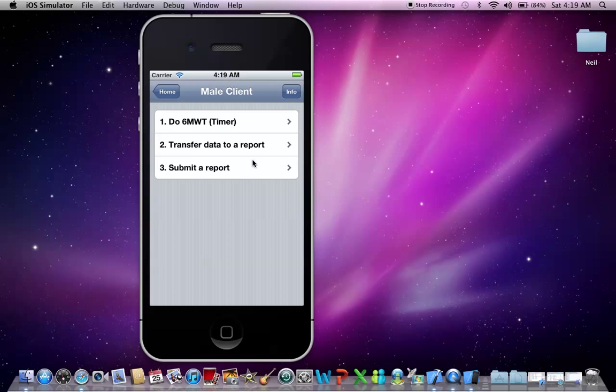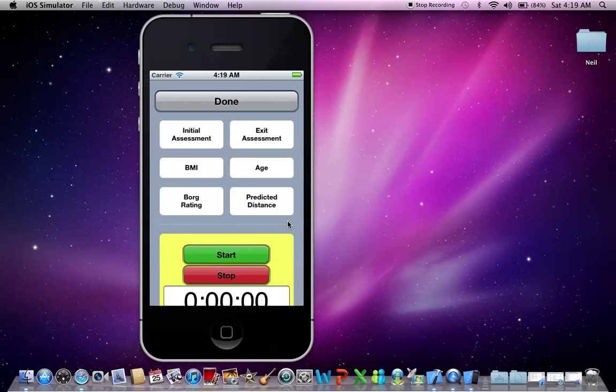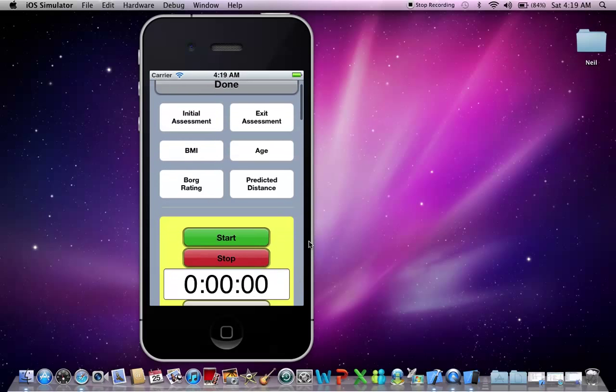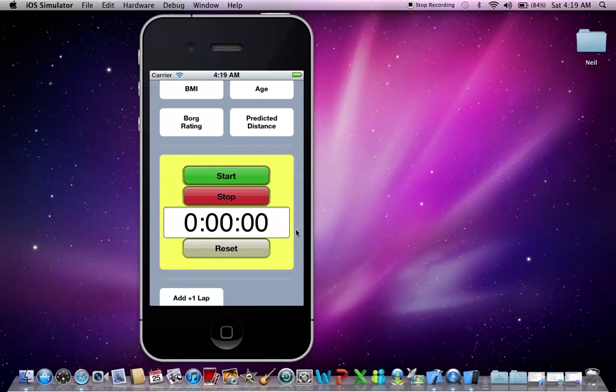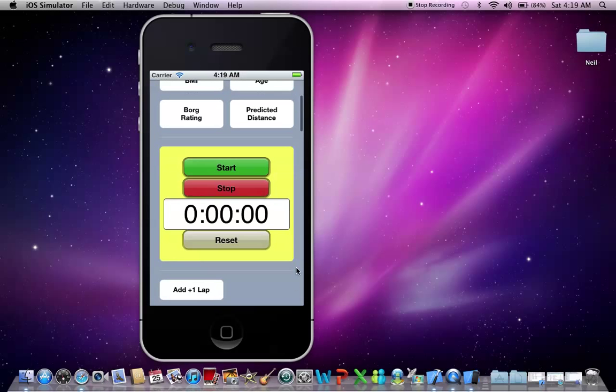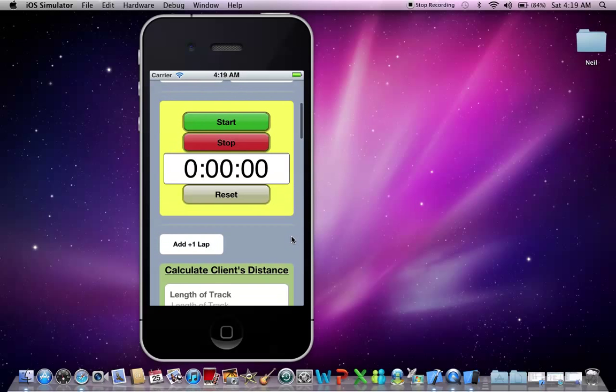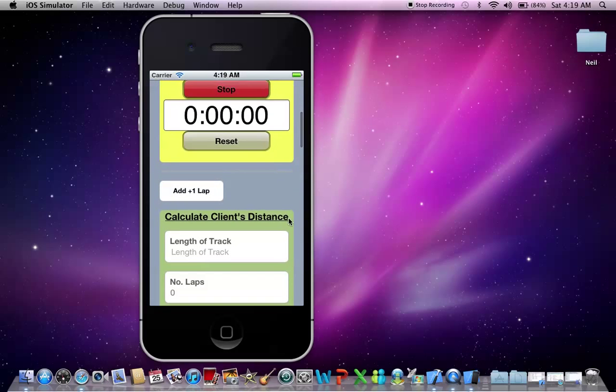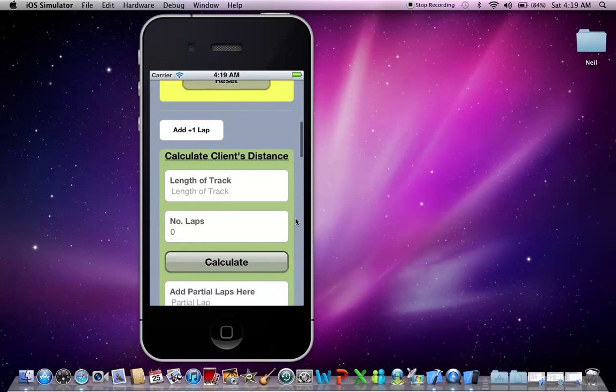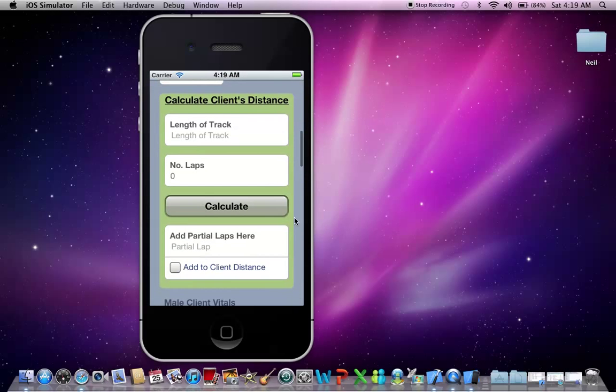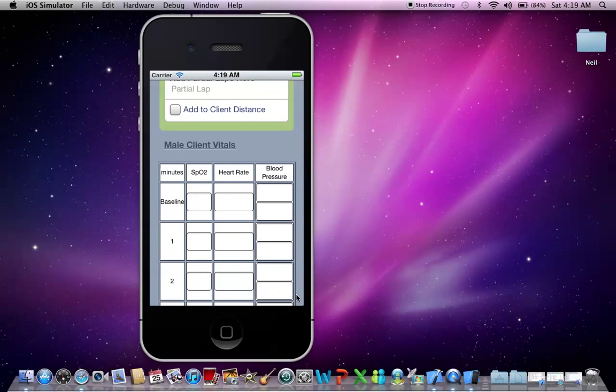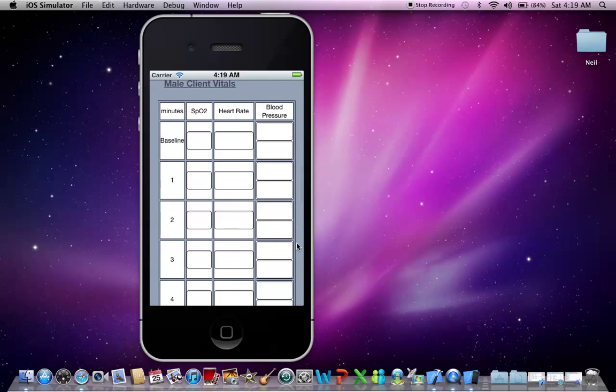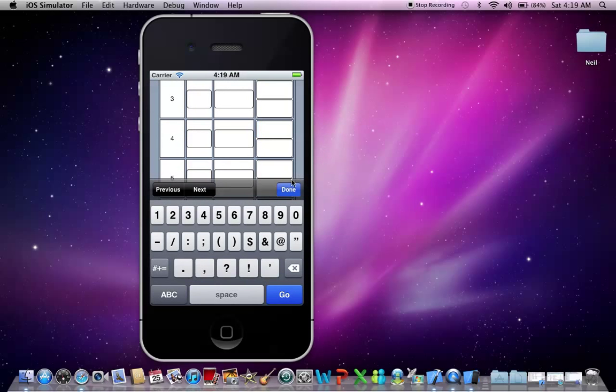Let's do the first step, which is to do the six minute walk test. As you can see here, you've got all your tools needed to conduct a six minute walk test and I'll just go through them in order. So you've got all your calculators, your stopwatch and a place to record your vital signs including blood glucose levels.